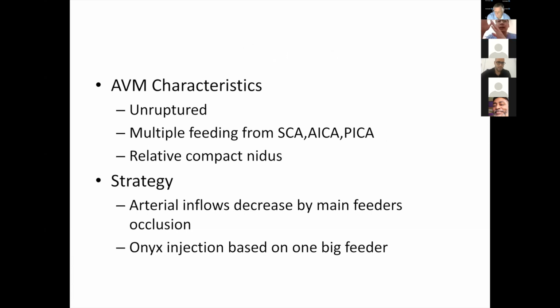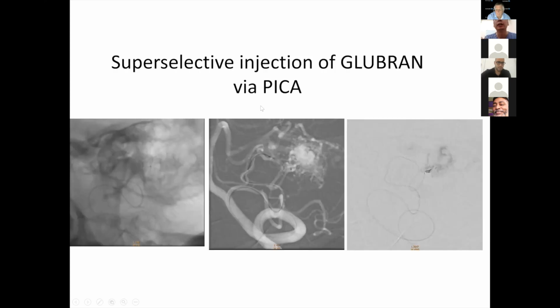I deliberately left one big feeder, through which I inject Onyx with the help of the high pressure cooker technique.